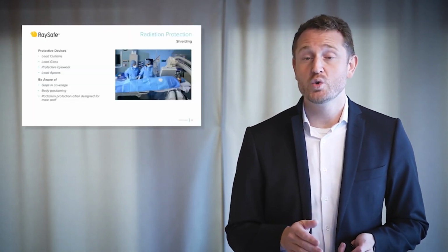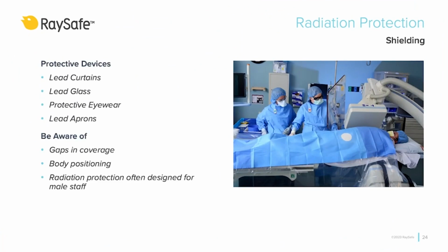Shielding can sometimes create a false sense of safety. Different shields are not equally efficient. Parts of the body may not be fully covered. There is no known safe dose level, so one should therefore always try to decrease the dose to a minimum. Depending on setup in the operating or surgery room and status of the personal protective equipment, the following areas can be worth having a closer look at.